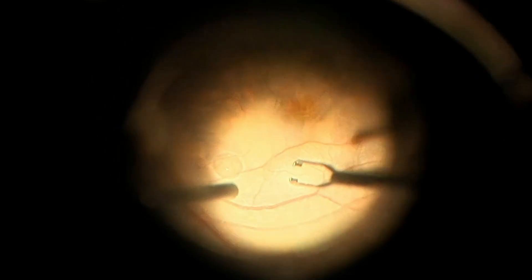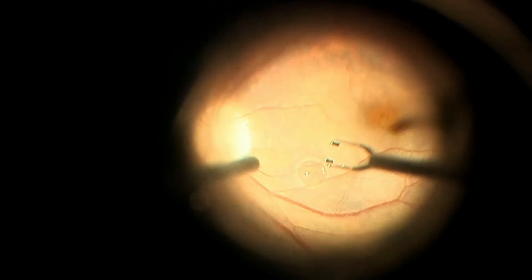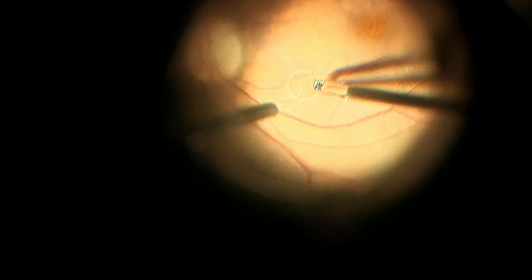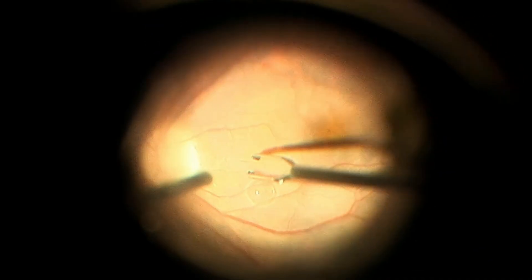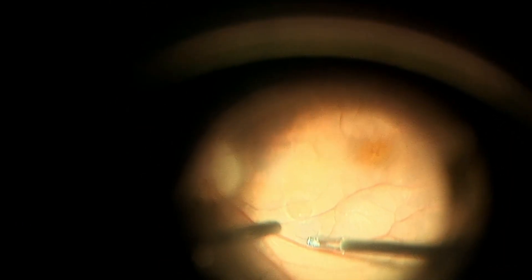The extent of the peeling, as mentioned earlier, really just needs to be localized — it doesn't have to extend into the more peripheral parts of the macula. It could just be over this supranasal area. What was done in this case is a localized peel right over the PFO bubble.